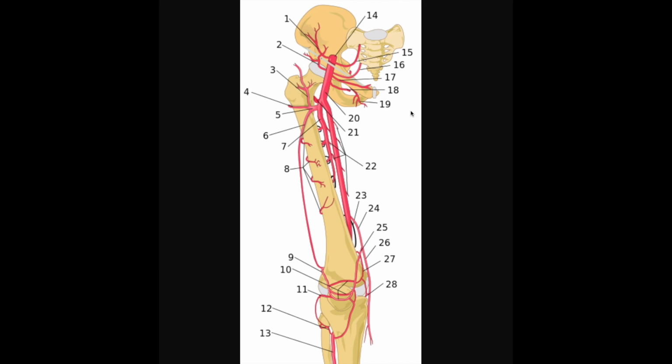And by injecting a very small amount of thrombin, we're able to create a blood clot in order to occlude that pseudoaneurysm. So the typical dilution is 1,000 units of thrombin in 1 cc, and you often don't even need 1 cc of thrombin. The important thing is to be careful. I mean, here we're not illustrating the aneurysm, but you want to have some neck. You want to be careful not to inject thrombin into the artery.